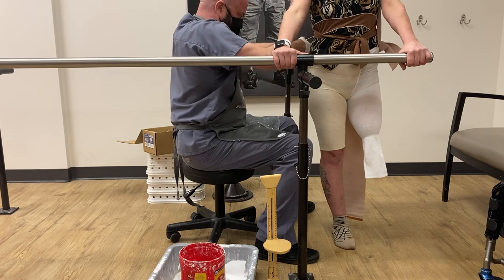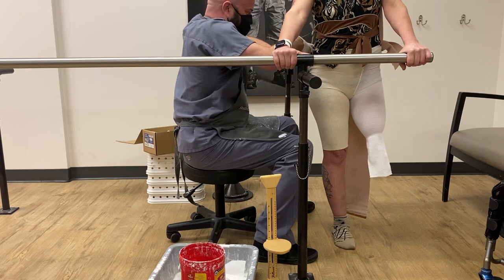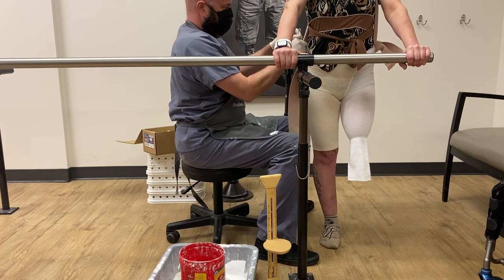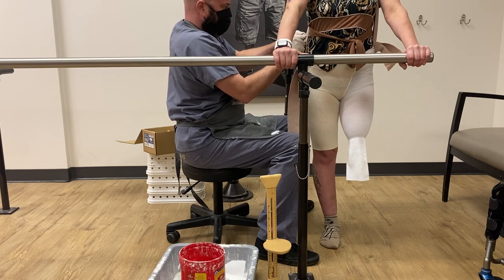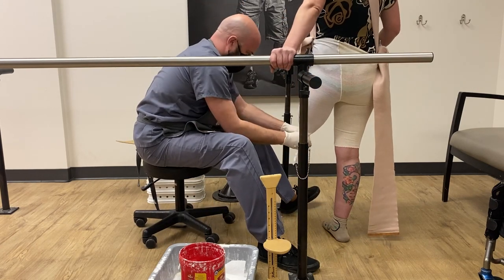Hell is where all the fun stuff happens — that's why people say 'hell yeah!' Is this uncomfortable? No, it's not. Well, it needs to be. It doesn't feel like it's going to split me in two? Don't cut my leg off — I need that!